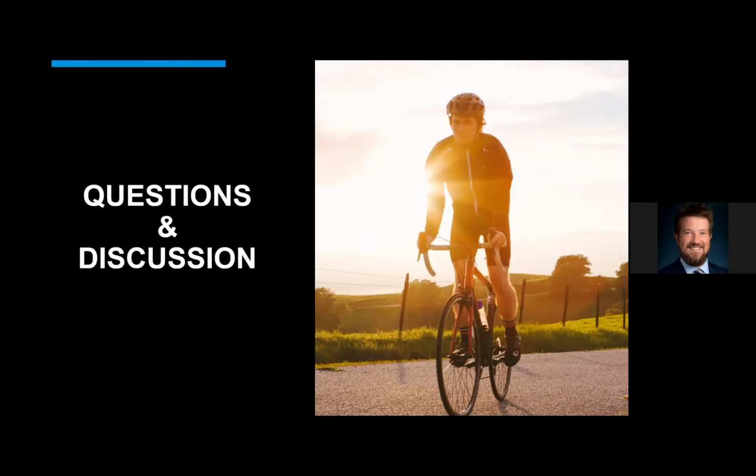So great job there. And then the only other point to make, we harp on this to residents and medical students and fellows all the time: knowing your landmarks, and in particular with the Baker's cyst, knowing where that cyst comes out of.